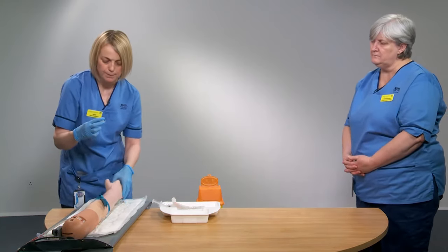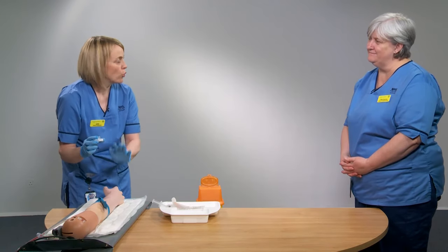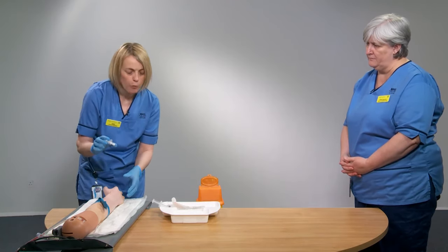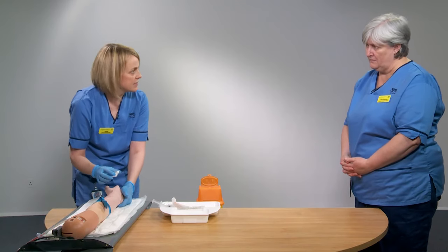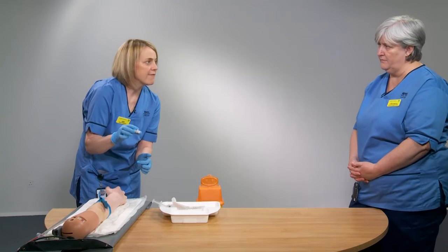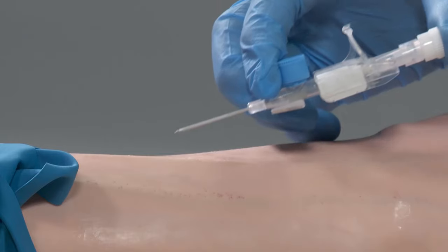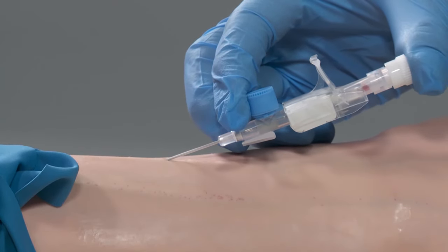Now that I've cleaned the site, I'm not going to touch it again as that would contaminate it. I'm going to use my dominant hand to go in at a 30-degree angle. What you should see if you're in the vessel is blood appearing in the flashback chamber — that's your first flashback. So at a 30-degree angle, I've pierced the vessel.